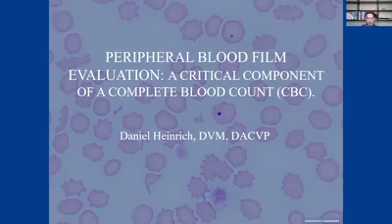My name is Danny Heinrich, and I am a clinical pathologist at the University of Minnesota College of Veterinary Medicine. I'm assistant professor here and the lab director for the ClinPath lab. And today I wanted to go over peripheral blood film evaluation with you guys and just go over some case examples of why this is so important and an often overlooked part of our CBC or our complete blood count.